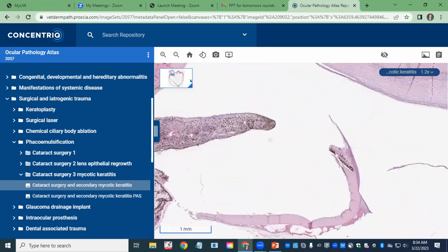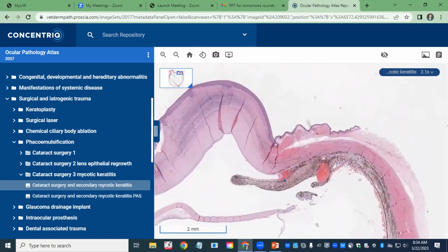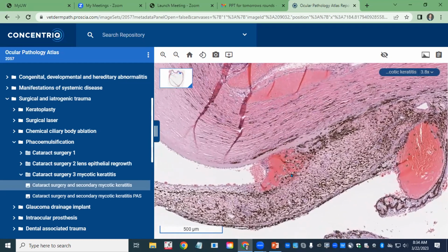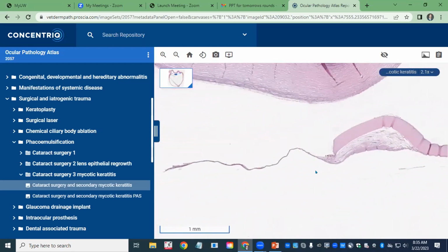So let's go over to the other side and look at this other side. So once again, there's a little bit of that hemorrhage. You can see it lined up on the ciliary body surface here, nestled between the ciliary body plica and the back of the iris, and a little bit here in the anterior chamber in the ventral iridocorneal angle. And so here's that nice PIFM again, pre-iridal fibrovascular membrane.